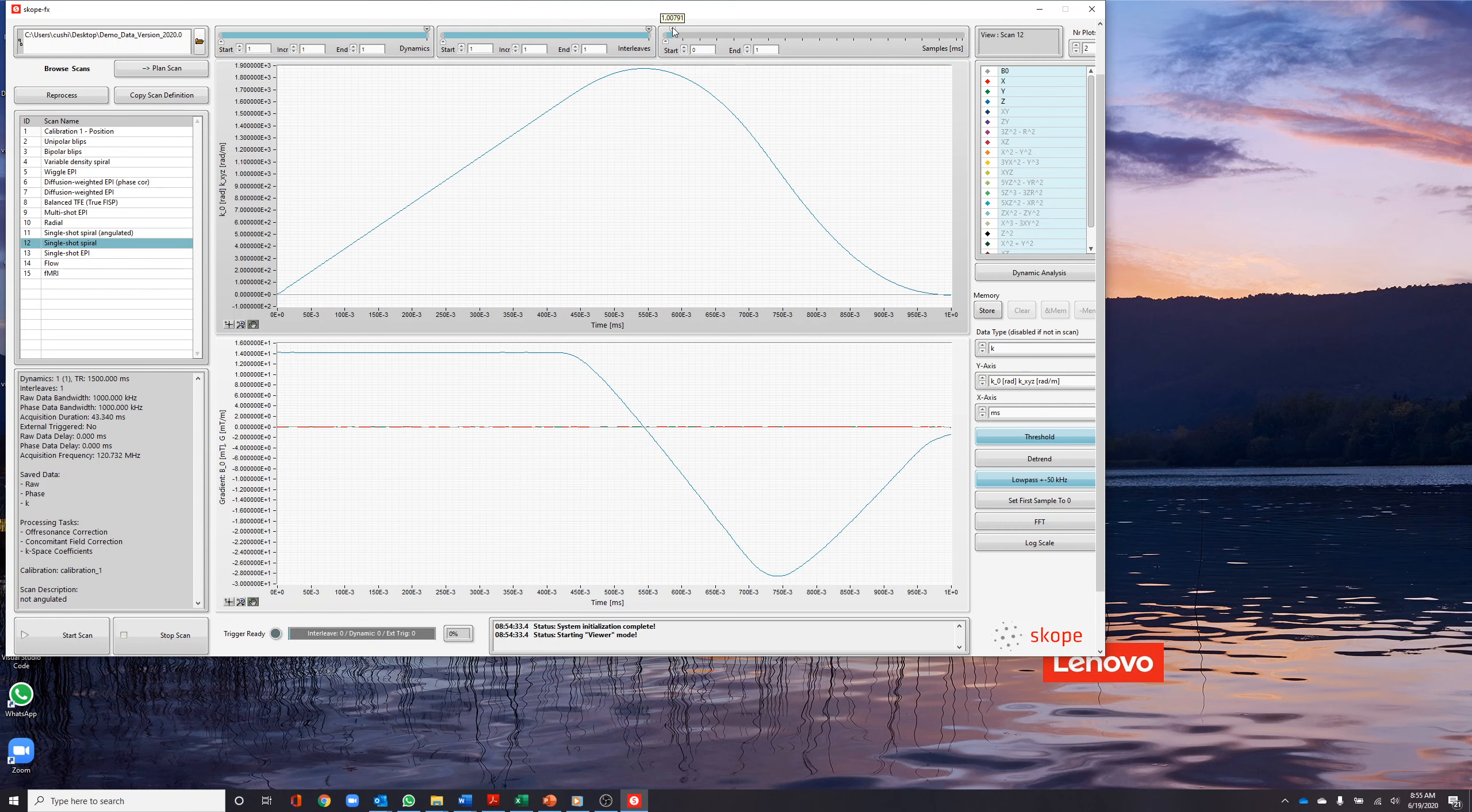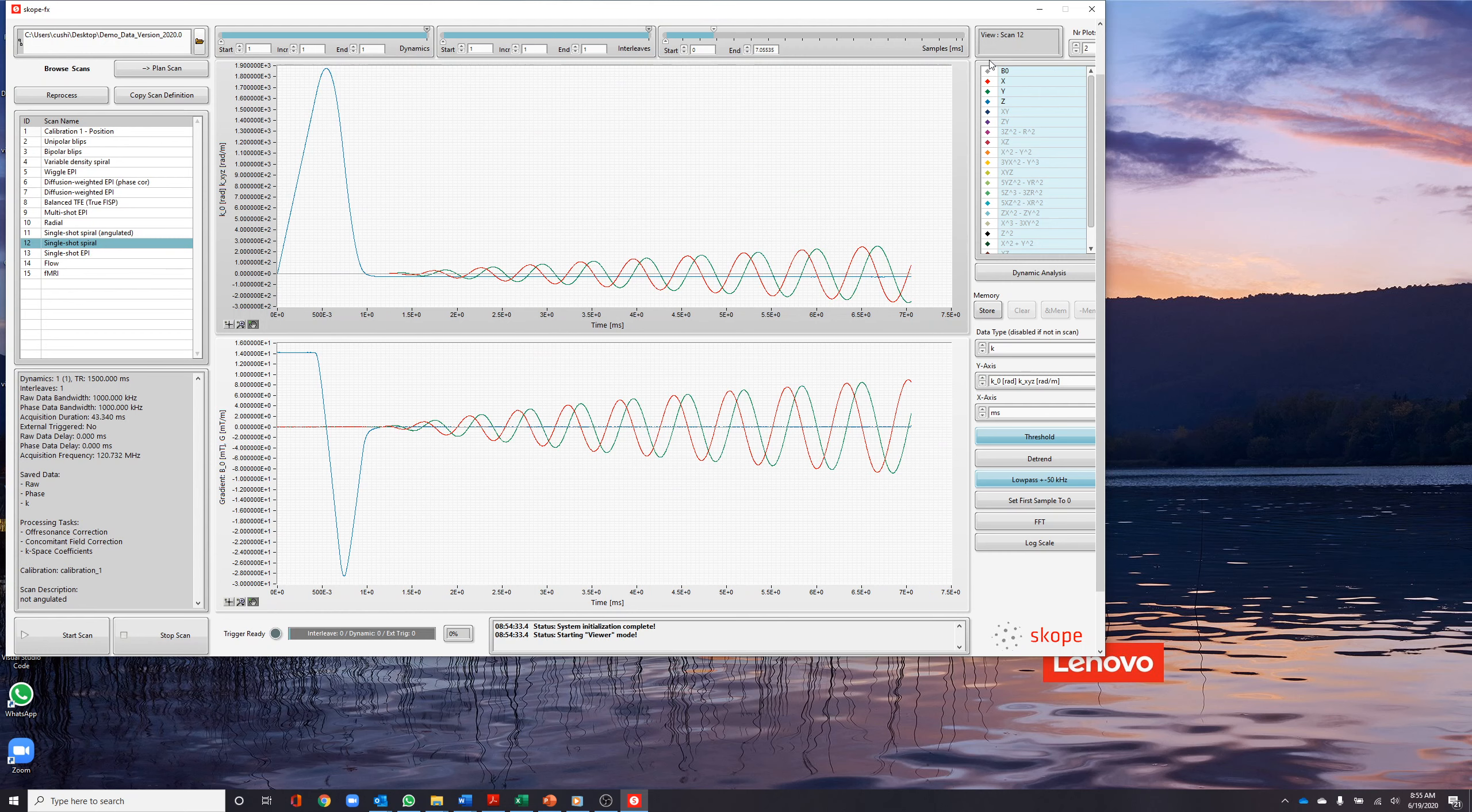The rightmost column allows channel or spherical harmonic selection, the selection of data type to be displayed, and data manipulations.